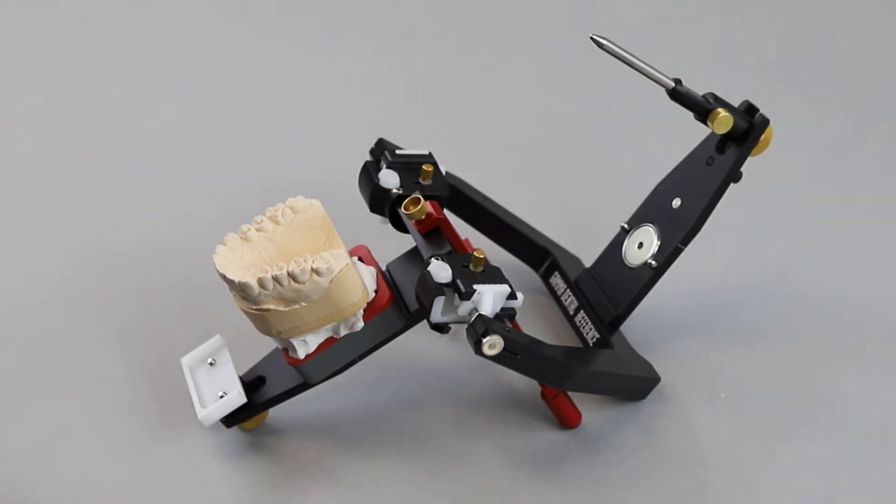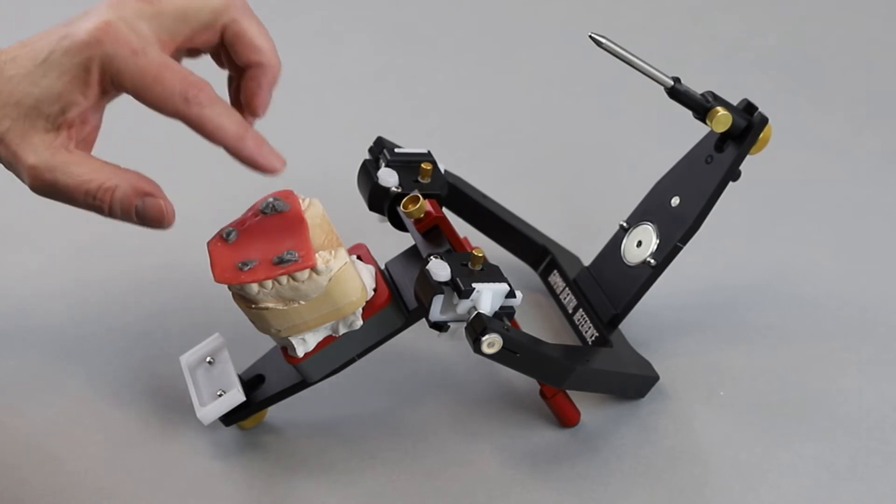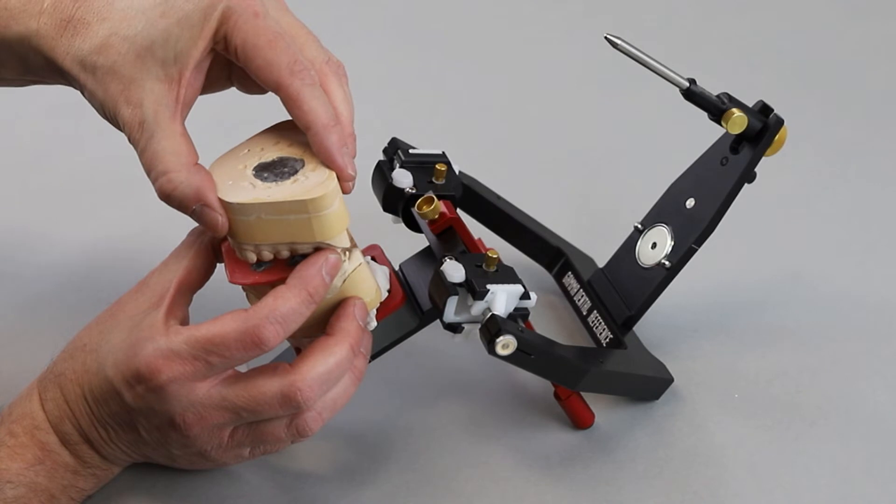Then carefully place the bite registration on the upper jaw model. Insert the lower jaw model on the registration imprints.